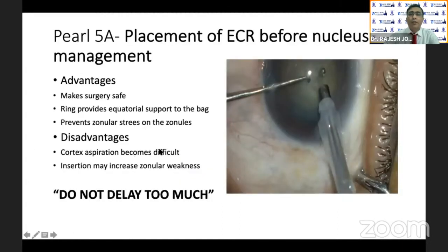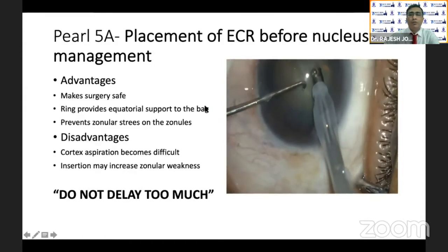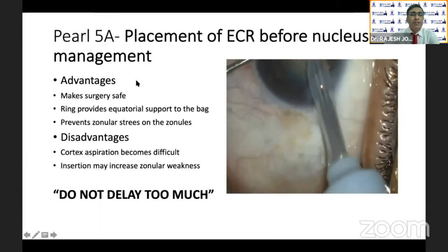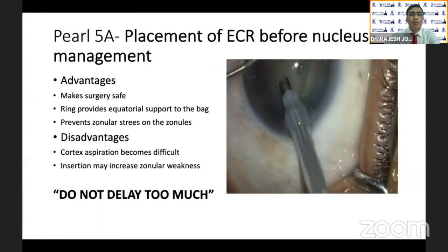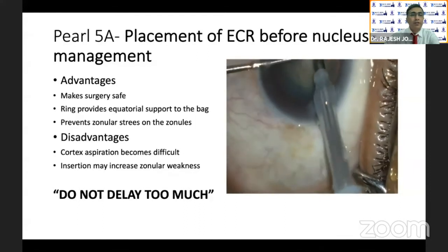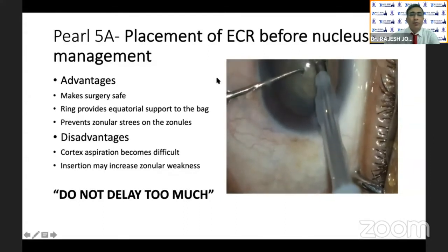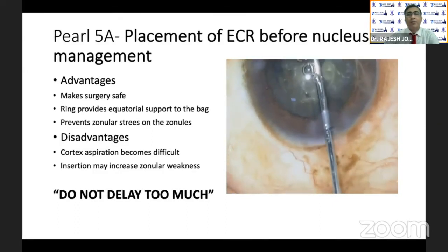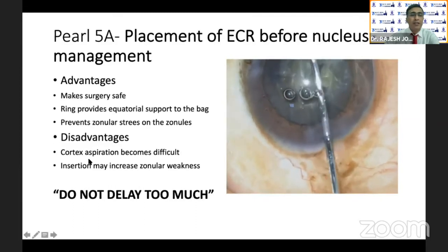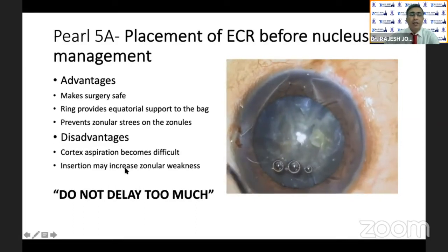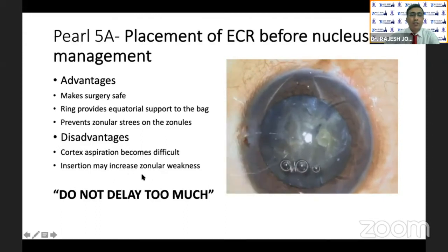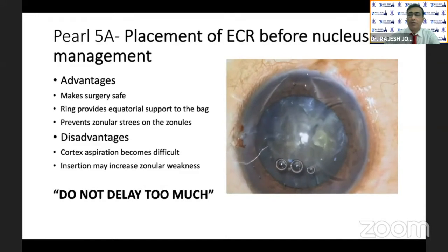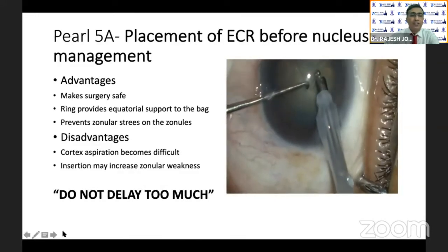Placement of the endocapsular ring before nucleus management makes the surgery safe as the bag is well supported. The ring provides equatorial support to the bag and prevents zonular stress. However, the disadvantage is that it makes cortical aspiration difficult, and insertion of the ring itself stresses the zonules. So do not delay too much for placement of the endocapsular ring — that is the dictum.